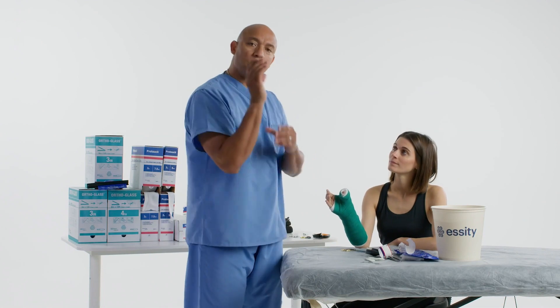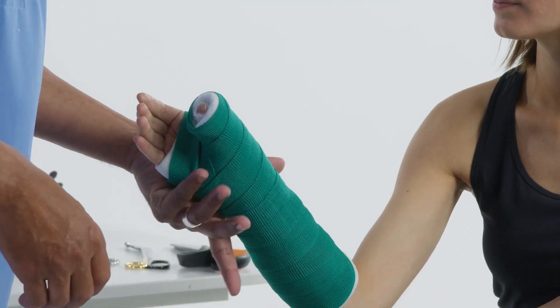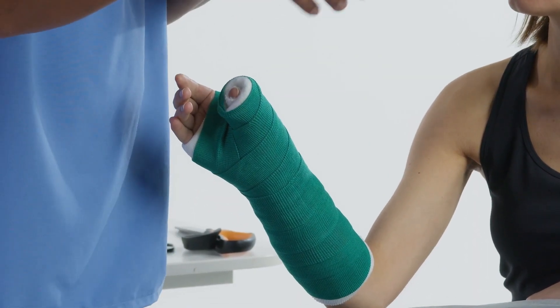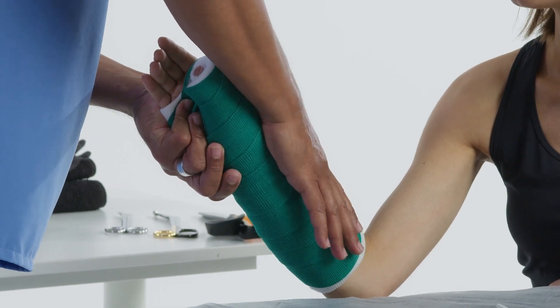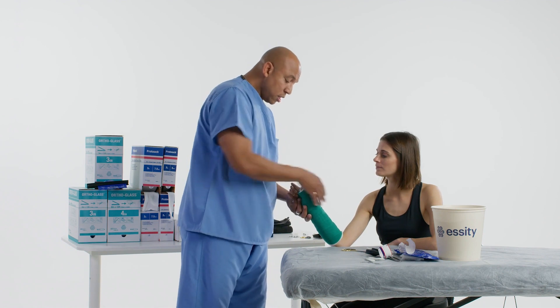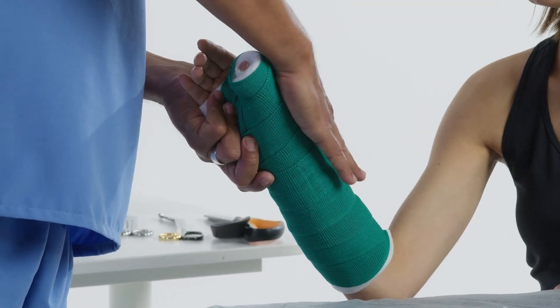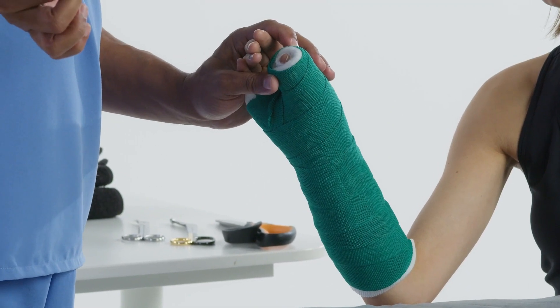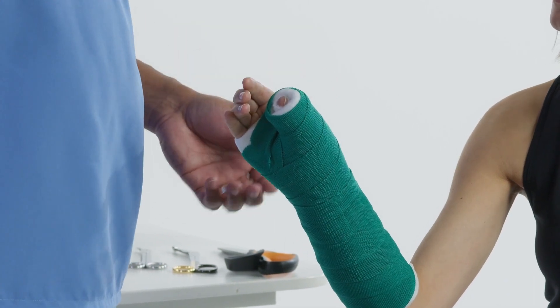Now let's get that position. Our position was 20 degrees of extension, and we want the index finger and thumb in direct opposition. Grab the hand — not extremely hard, just grab it — and take that patient out of what we call ulnar deviation. If their hand is hanging down, lift their hand up slowly with one of these motions, not too aggressive. Then get some extension of the hand, about 20 to 30 degrees. Slowly lower the thumb down. If the thumb was up in the air or too far extended, just lower the thumb down in this motion, then secure that thumb and hold it just a little bit. The faster you put this on, the splint material is going to be really soft, so it's easy for it to contour around the patient's extremity. Hold that to keep all articulation of the thumb movement.